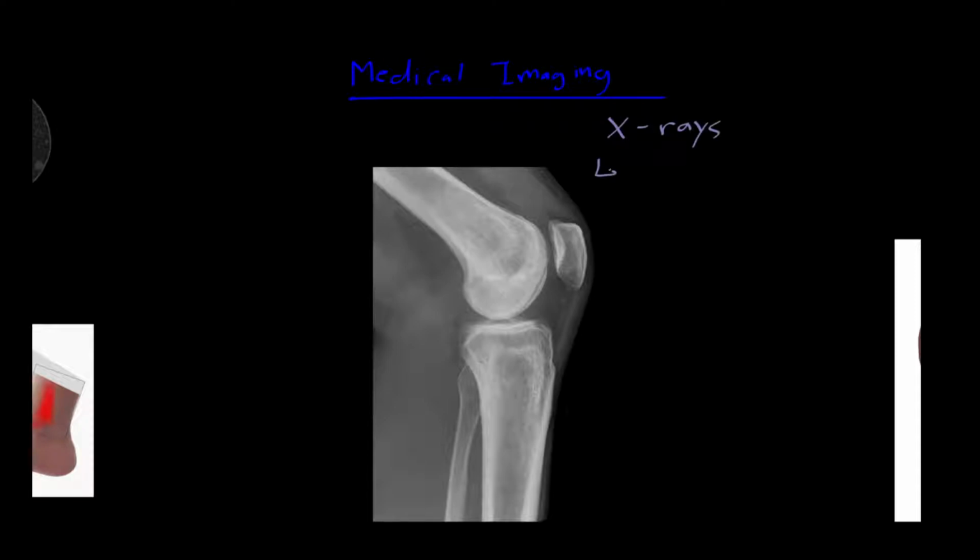These are sometimes also called radiographs. This is why people who interpret medical images are called radiologists. These are very old, so this, I think, probably over 100 years ago, X-rays were discovered. It's called X because it was unknown. It was like some unknown source of radiation. But today, X-rays are a relatively high-definition way to image bone specifically. You can image a few other things with it, but really this is for bone.